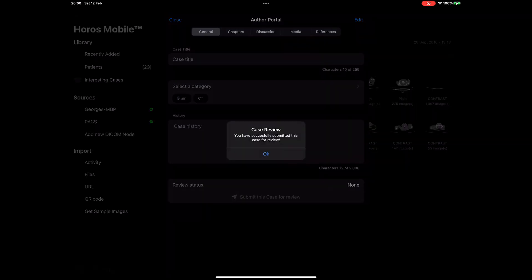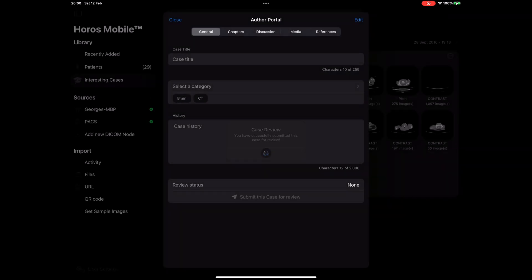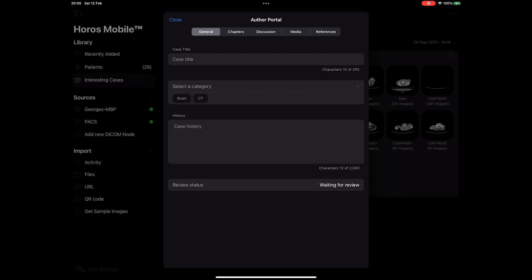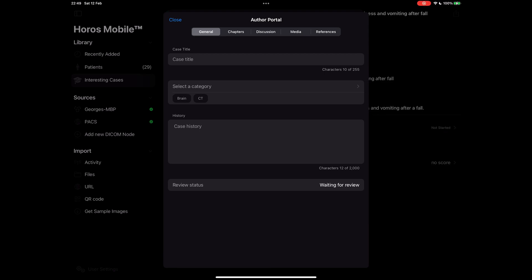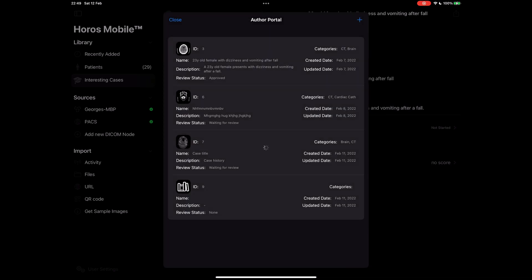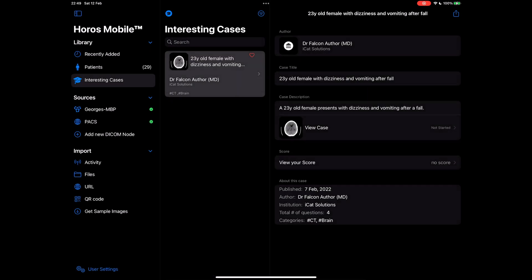A message will inform me that my case is waiting for review. Once it has been approved, I will get a notification informing me that it has been published and is now visible for everyone to access. Let's check some of the already approved and published cases. We can see a case here that has been submitted previously and has been approved. Tap on the case card to reveal the details of the case.